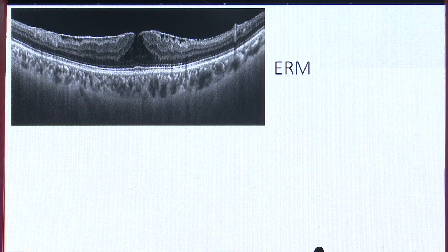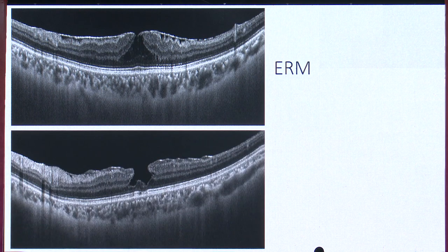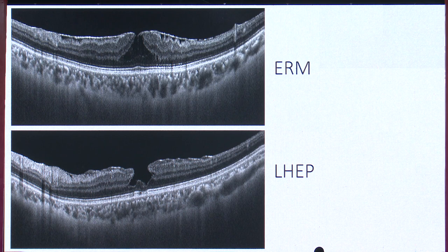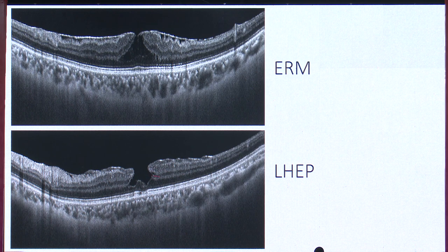Regarding ERM: a newer terminology is lamellar hole-associated epiretinal proliferation, or LHEP. The difference here is that there is a thick, homogeneous membrane spanning the retinal layers with medium reflectivity, completely attached to the retina. The origin is suggested to be Müller cells, and therefore they are connected to the middle retinal layers.